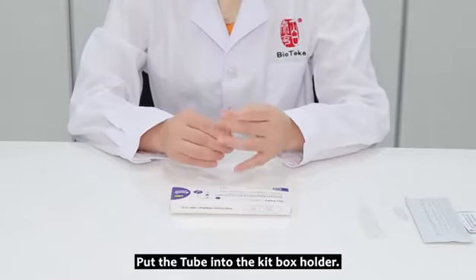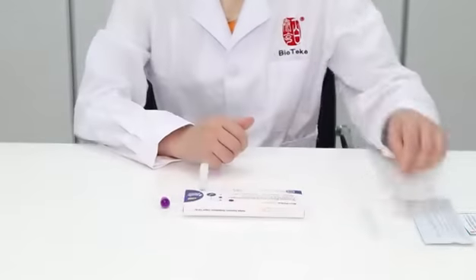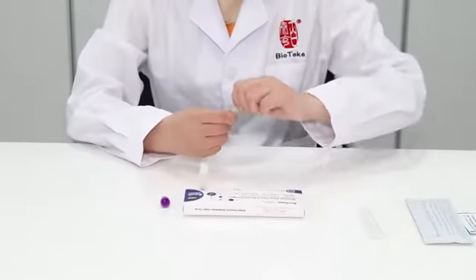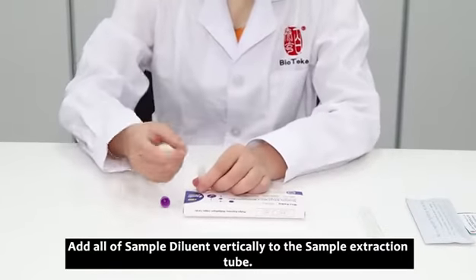Put the tube into the kit box holder. Add all of the sample diluent vertically to the sample extraction tube.